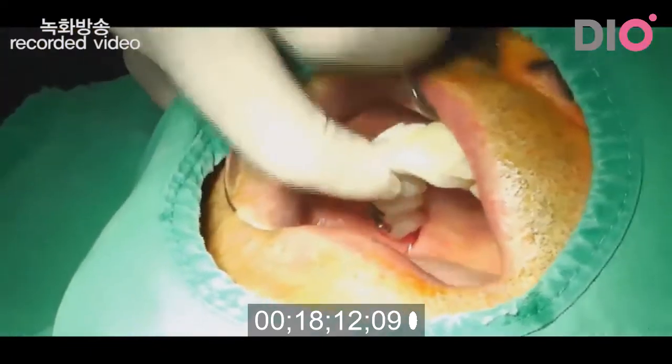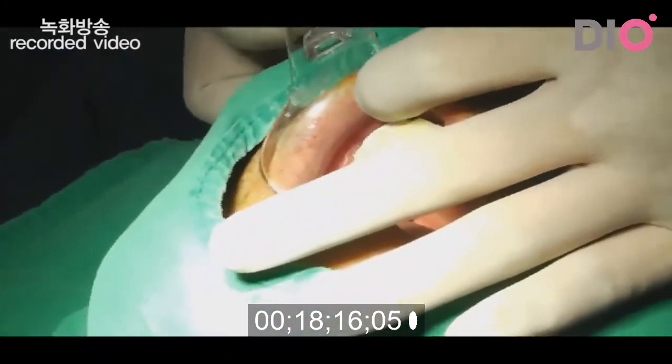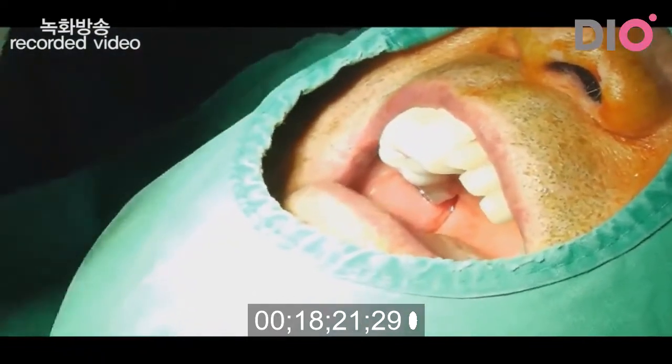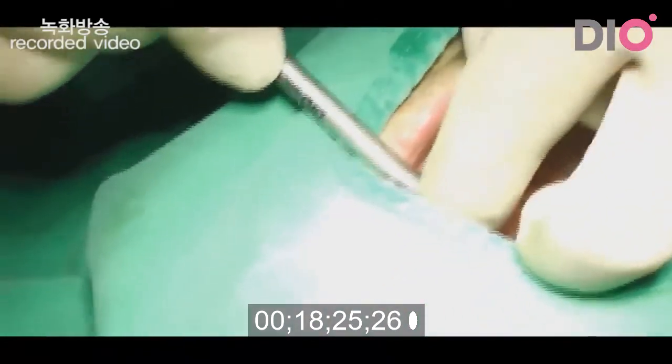Okay. And then implant. It's now implant is a 5.0 diameter implant.